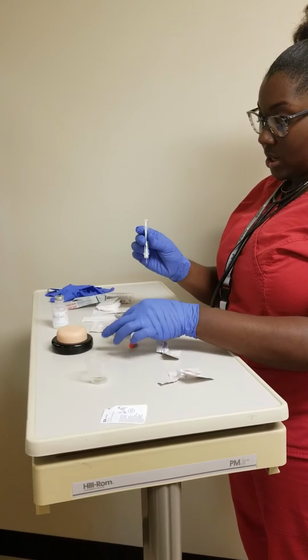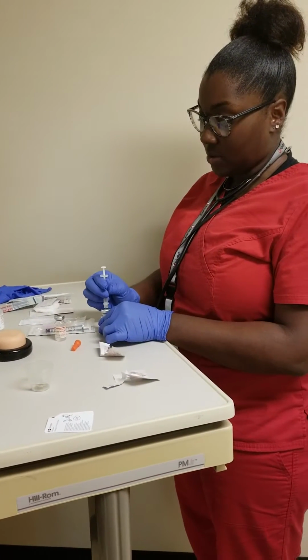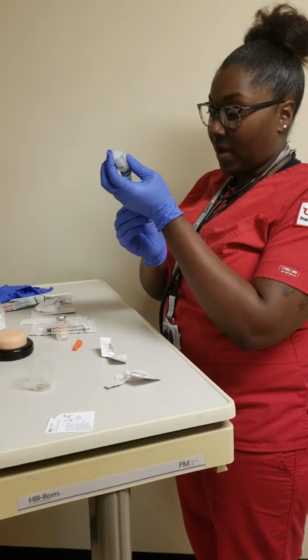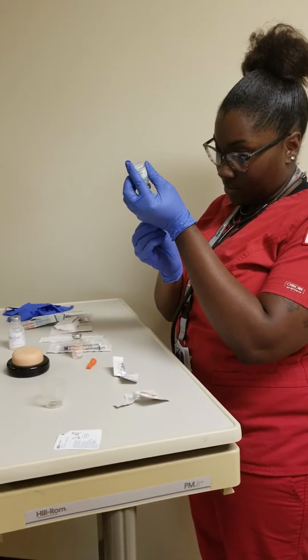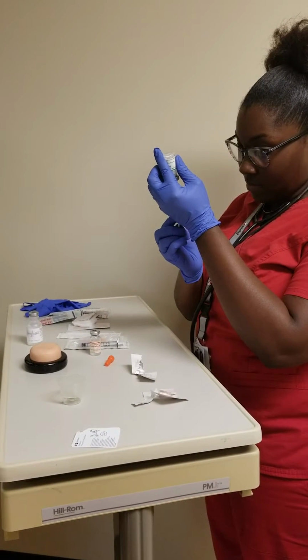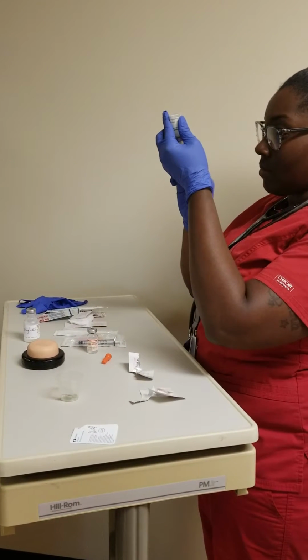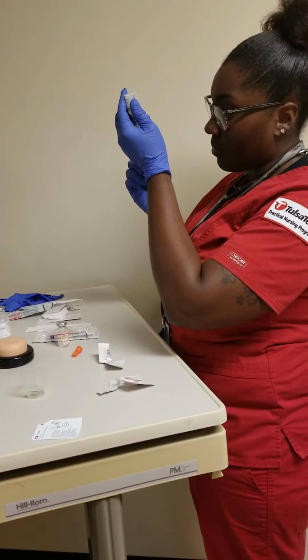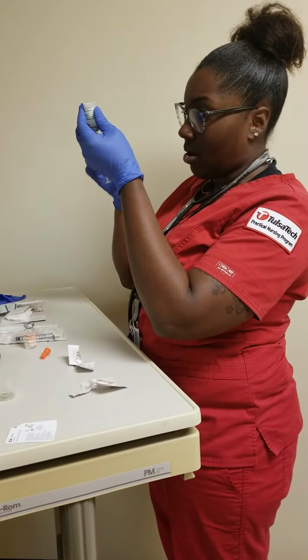I will inject this into the vial of the NPH first. I will draw up 5. Make sure there aren't any air bubbles.